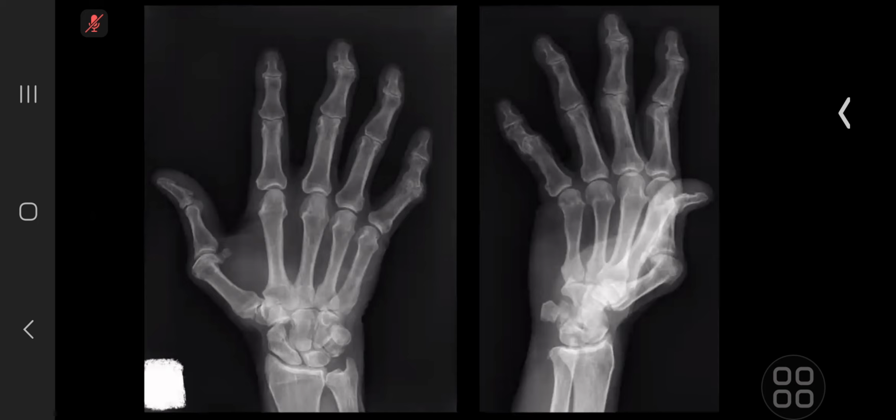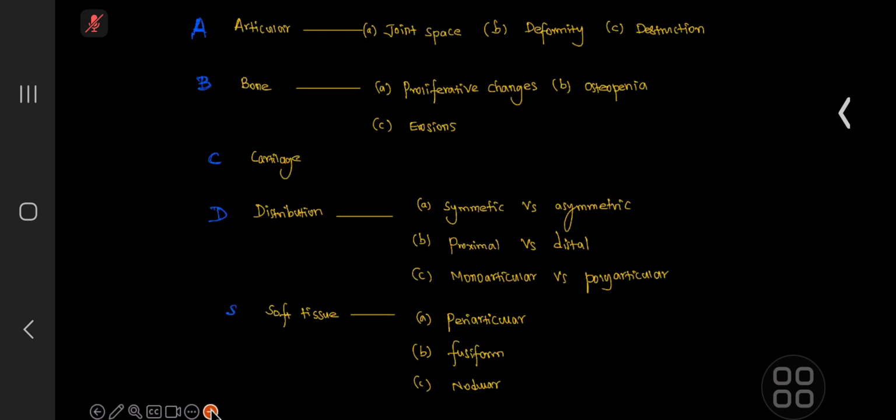Well, I'll just briefly give you some teaching on how you approach arthritis cases, especially if you encounter them in the exam. It's very unlikely that you will not get an arthritis case in the exam. So just stay with me. I'll highlight how to approach arthritis.